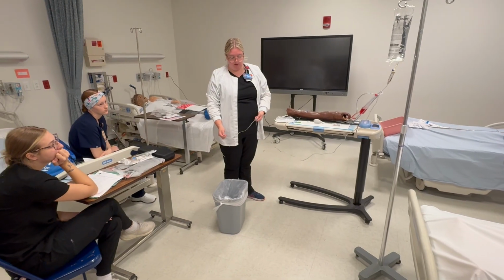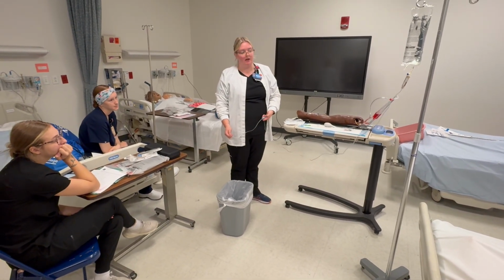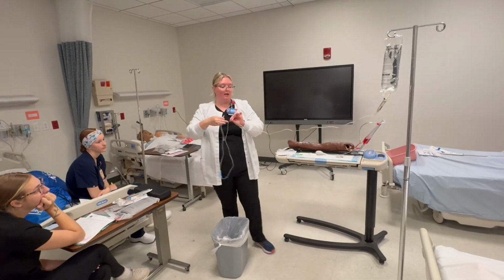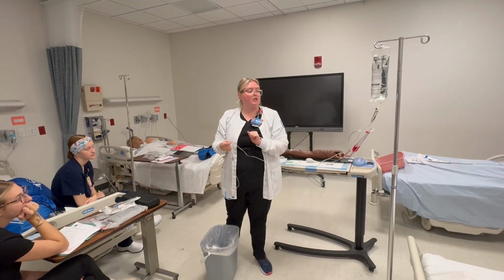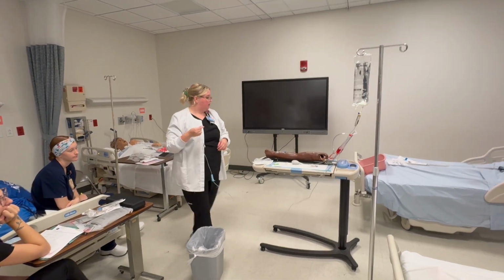Okay, roller clamp gets clamped back. You just move it up and down, okay? So I'm gonna inspect my tubing. There's no air in it. I'm making sure not to touch this to things. Great. I already did my third check.